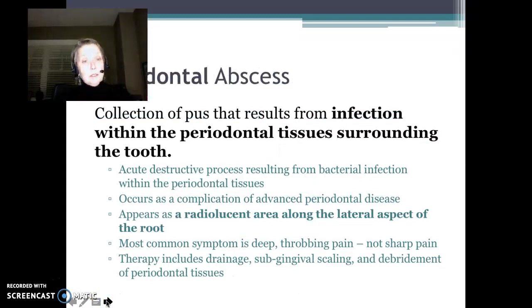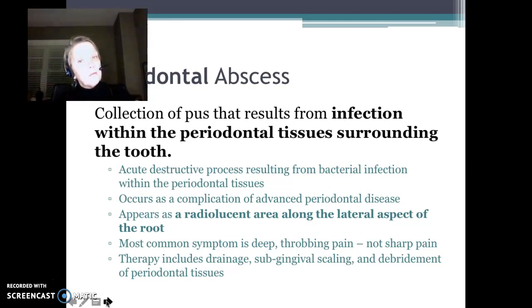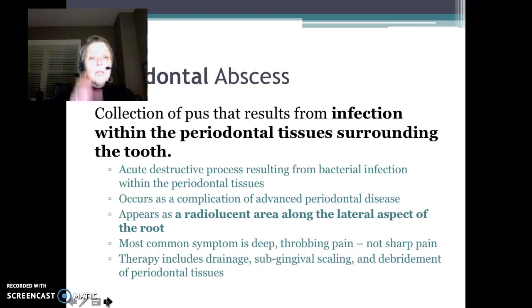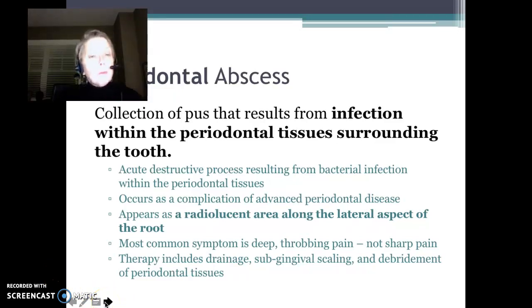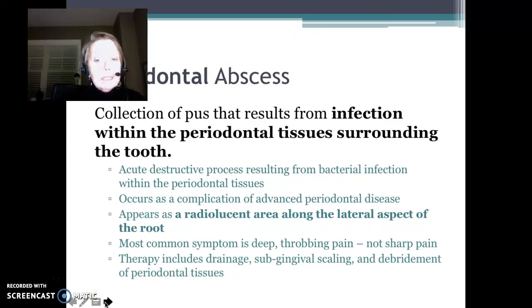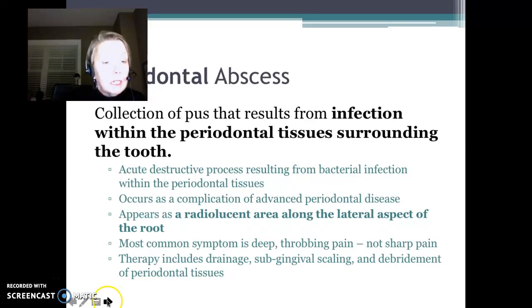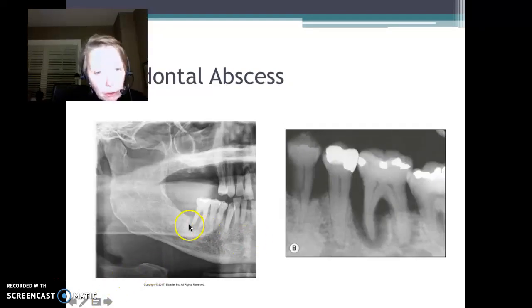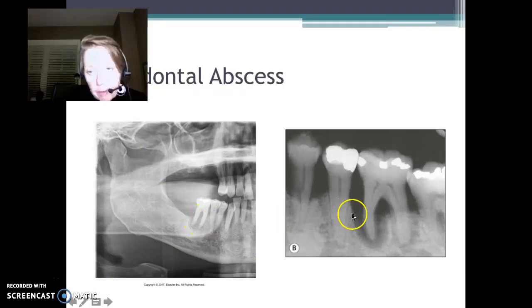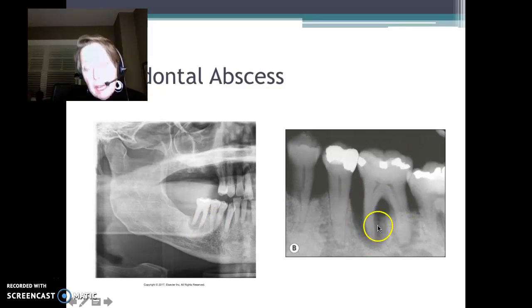Now let's go to gum tissue abscesses. Is the infection from the pulp — the nerve of the tooth — or from the supporting bone and structures? A periodontal abscess results from infection within those supporting periodontal tissues surrounding the tooth. It appears as a radiolucent area along the lateral aspect of the root. Patients with periodontal abscesses won't present with sharp pain — it's a low-grade, deep, throbbing pain. Treatment requires antibiotic treatment, subgingival root planing and scaling, and debridement. Take a look at teeth 30 and 19 — these are periodontal abscesses. This patient has lots of bone loss and the area has become abscessed over time.